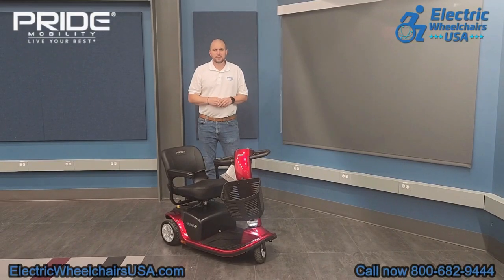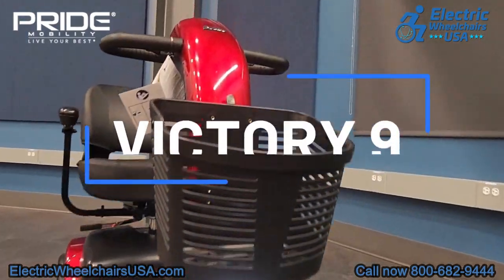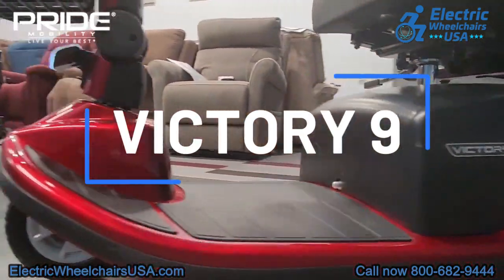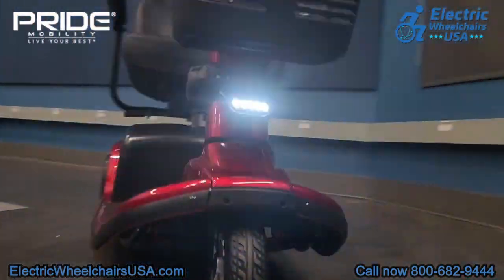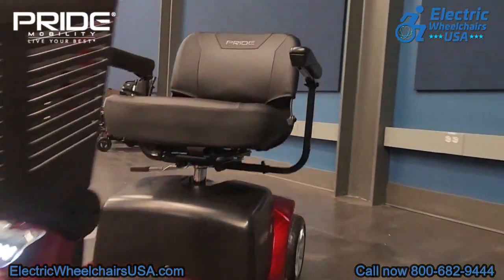Hi, welcome to the Electric Wheelchairs USA Mobility Experts channel. In this video, we're going to go over the Pride Victory 9 three-wheel mobility scooter. This is model number SC609. This is a great full-size mobility scooter that can support up to 300 pounds of weight.